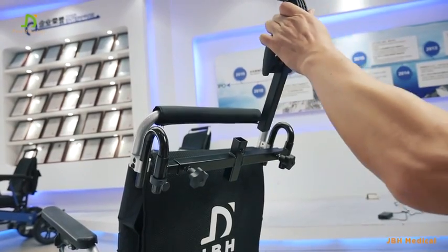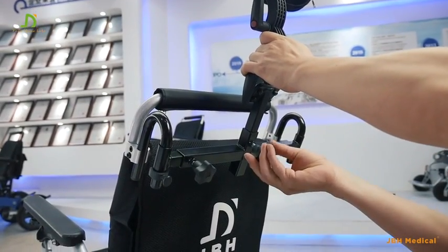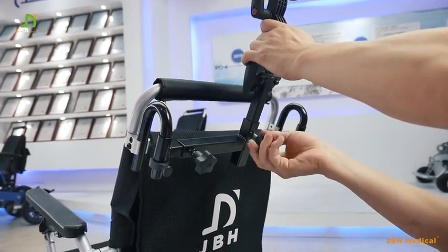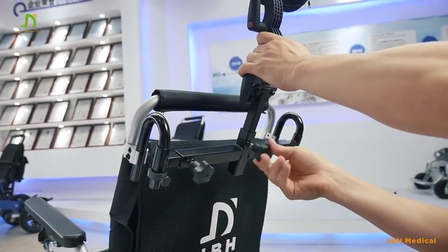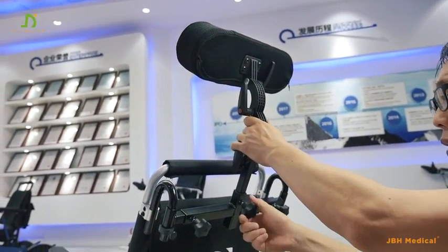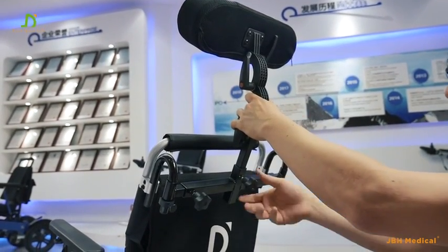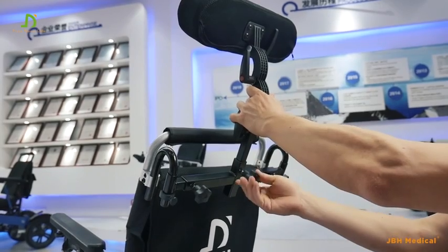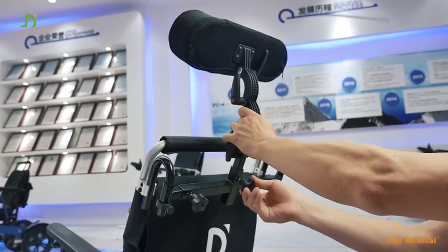Let's insert the pipe of the neck rest in here, fixing it with this knob. Tighten it. That allows you to fix the position of the neck. You can also make a small adjustment when needed, depending on the height of the user — up and down.